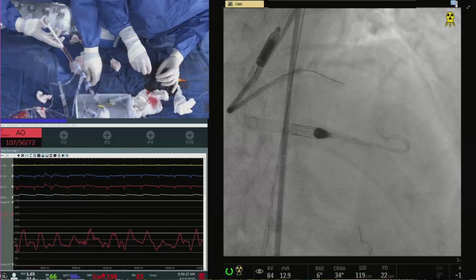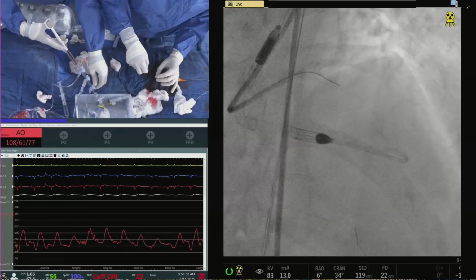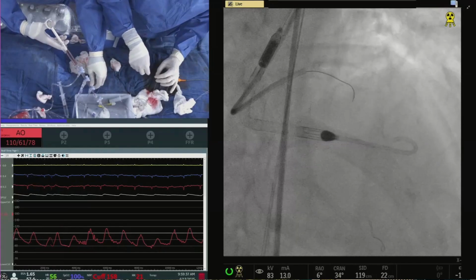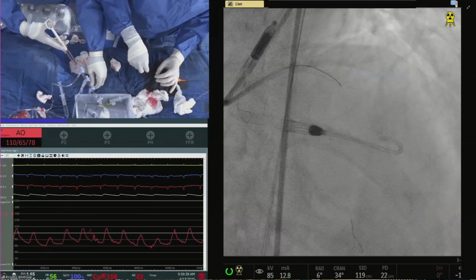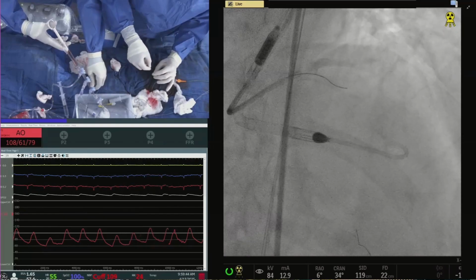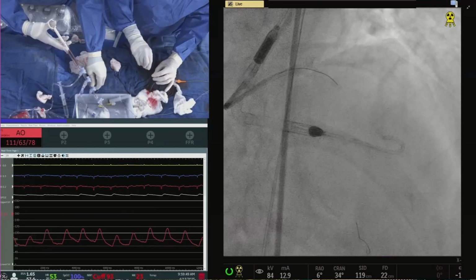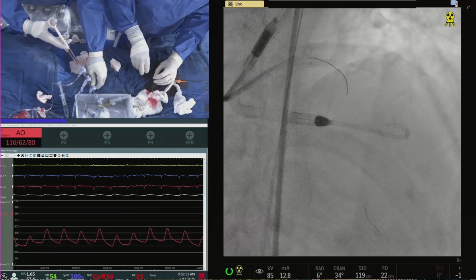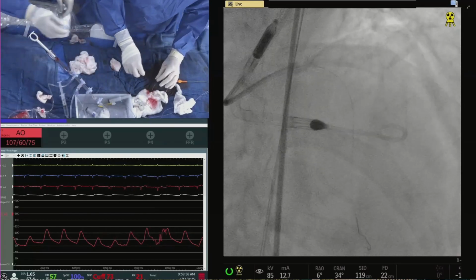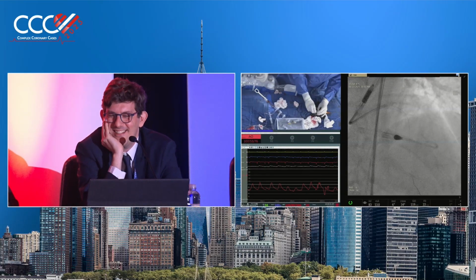So if we now, maybe the vessel is dissected. Let us try to get in the lumen with the entire vessel that's dissected, yes. If we were in Italy and Antonio was there, Davide, you want to say what he would do? He'd probably put a bunch of drug-coated balloons there. Would that be wrong? Davide Capodanno? No, you know, what he's now saying is that it's not the DCB per se, but the strategy. So DCB plus bailout scaffold these days, rather than DES. But we need data on that.